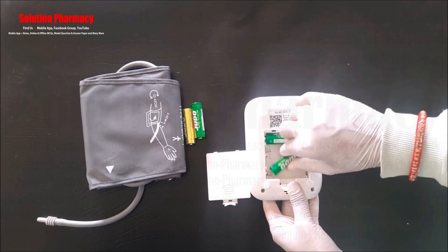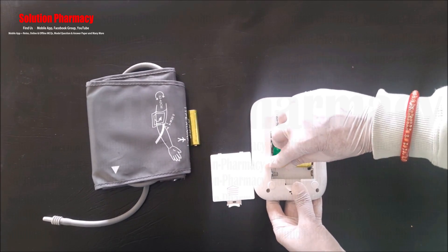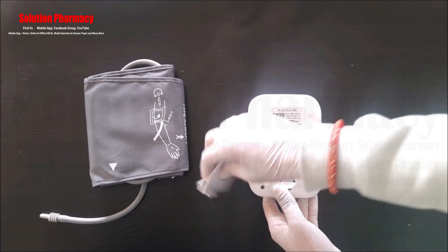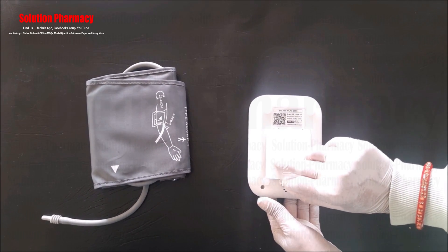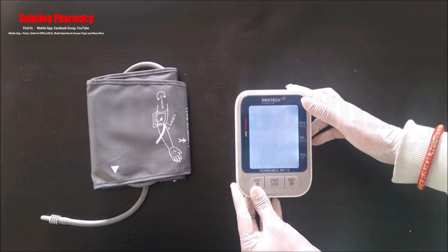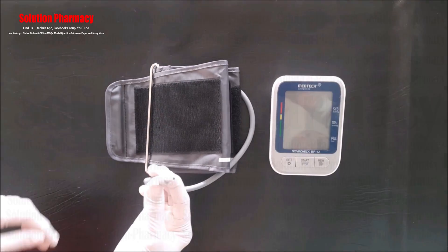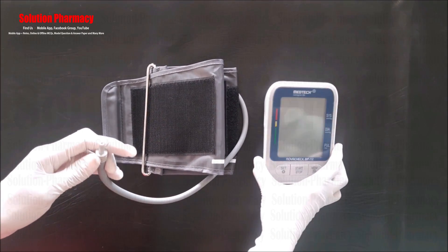Insert the batteries according to the indicated plus and minus signs inside the compartment — fit the plus side of the battery to the plus sign and vice versa. If the BP monitor is left unused for a long period, it is better to remove the batteries for longer device life. After inserting all four batteries, the machine will turn on.